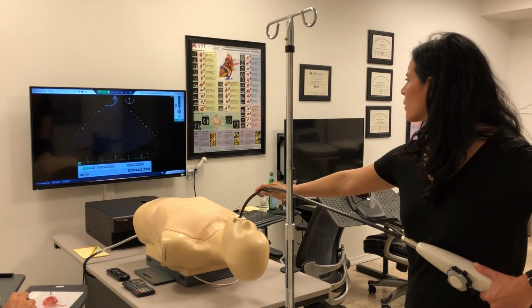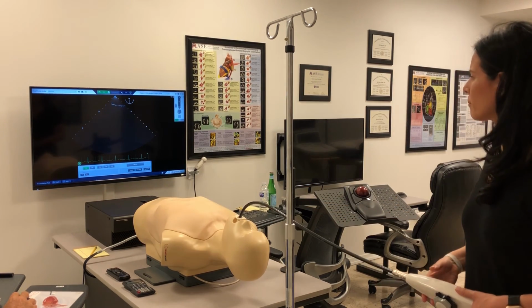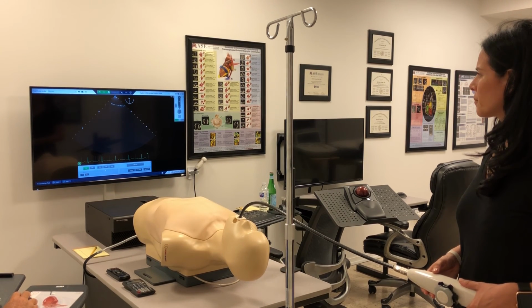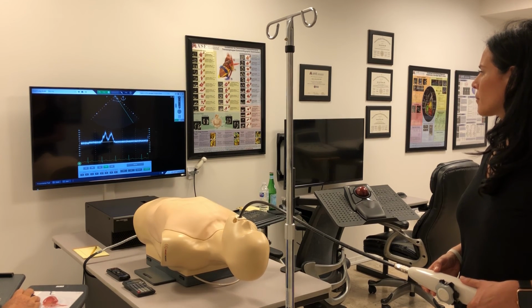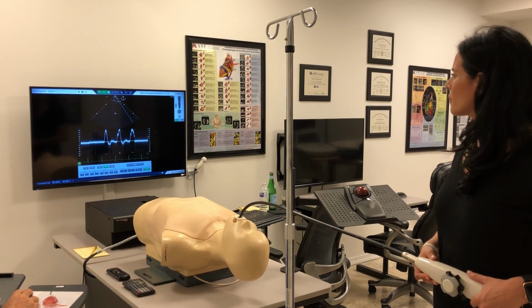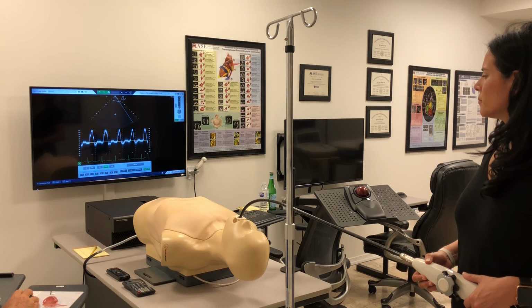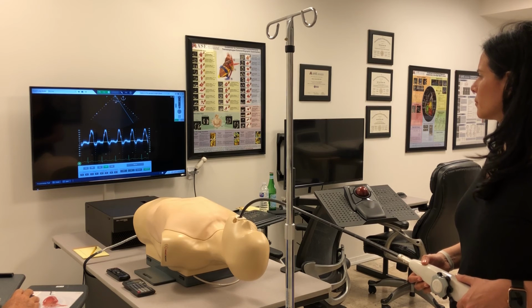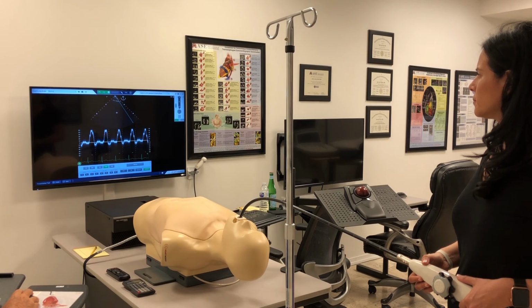And you may want to just insert the probe a little bit because I think you kind of got it a little bit towards the arch. Nice, good. That's perfect. And this is the long axis of the descending thoracic aorta. This is the view in which you do a PW of the flow coming down the aorta. Remember, the patient's head is on the right screen and the patient's feet, caudad, is left screen. So the systolic flow with the PW cursor placed closer to the right screen will show the systolic flow above the baseline, as illustrated here.